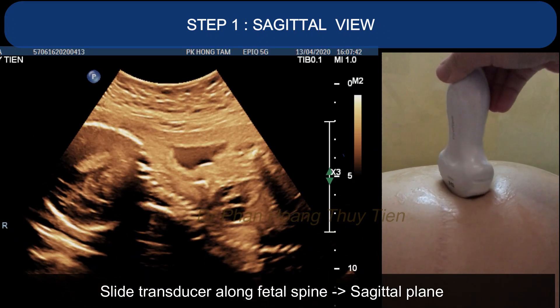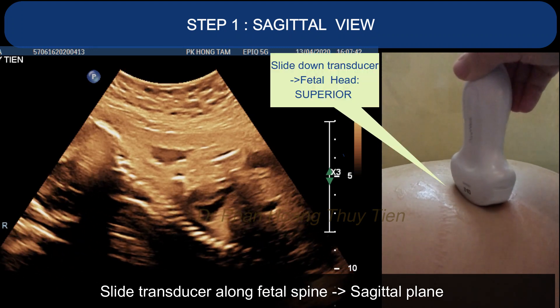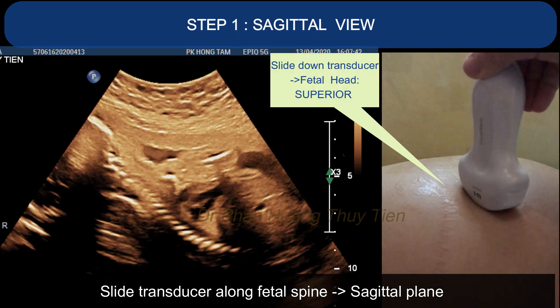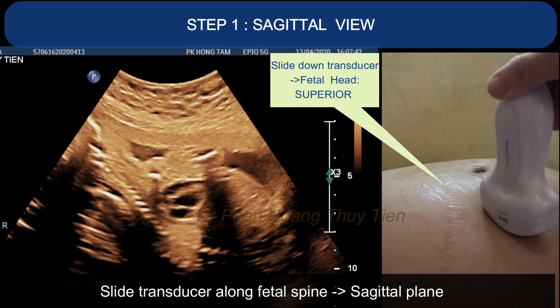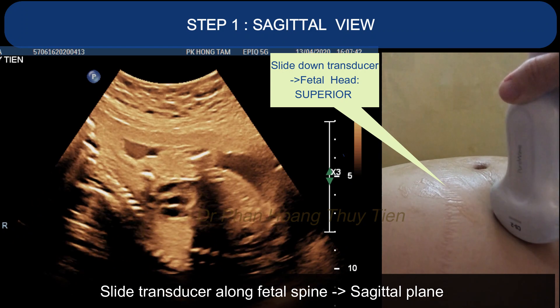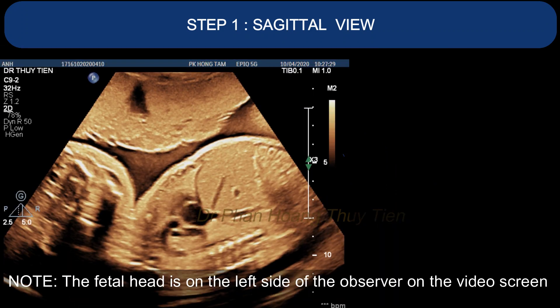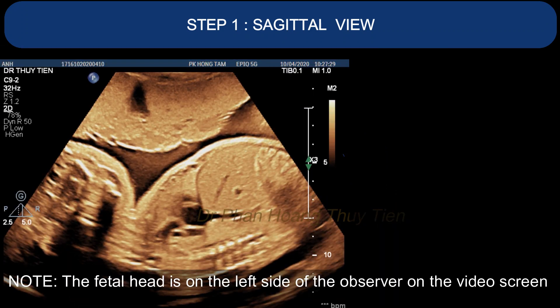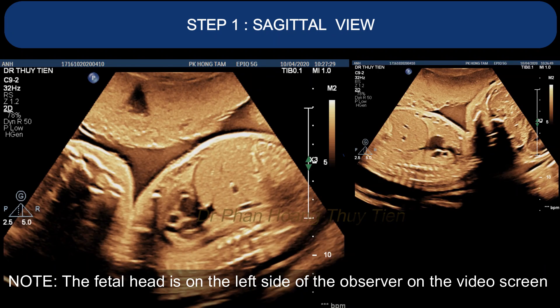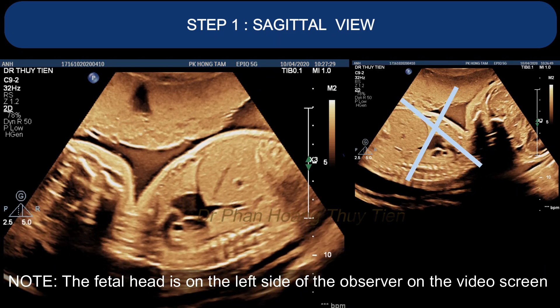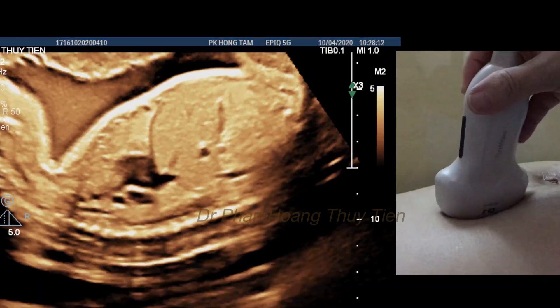Next, you will sweep the transducer downward from the fetal neck along its spine to obtain a clear central view of the fetus. Please be aware that the fetal neck is on the left side of the observer on the video screen.